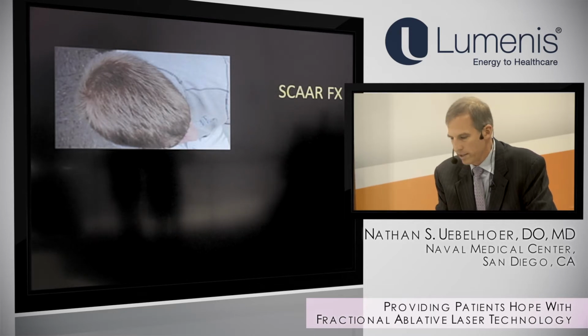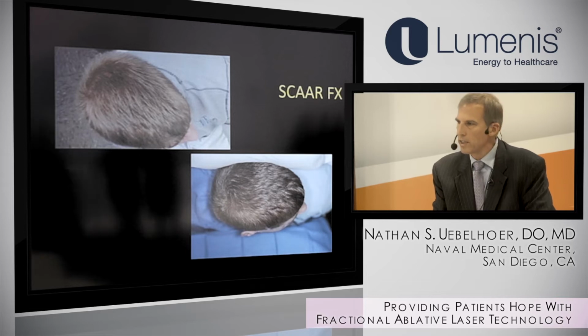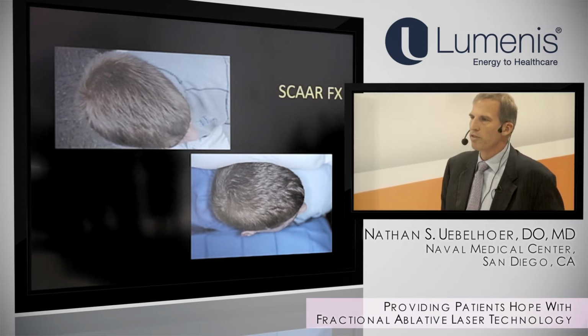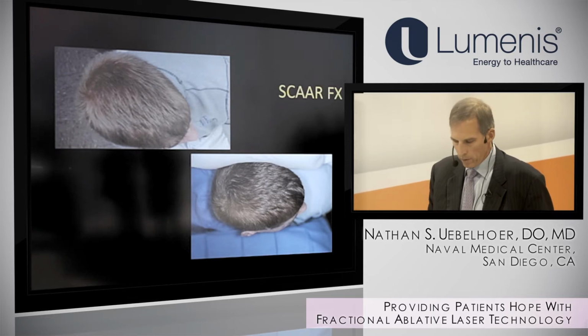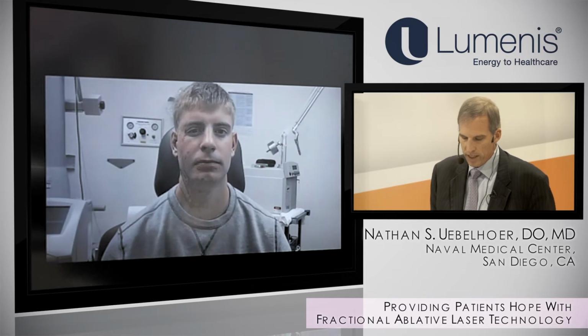We treated him twice, and he was able to bring his nose all the way to his shoulder. He still had tightness. He still had the scar, but he had a dramatic improvement in his range of motion, which was very significant for him, and is a classic example. Here's a nice video of it.